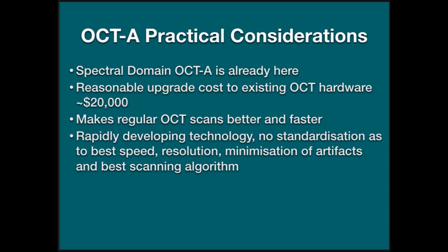We don't know what the best speed is to scan the retina. You know, the quicker we scan, the easier it is for the patient, but we'll miss blood flow because we're sampling too quickly. You know, what resolution do we need? Is it okay to scan each location twice or four times? The new NIDEK software that's just about to be installed will now do eight times, but is eight times going to be really better than four times, or is it just going to make the scan run longer? You know, what are we going to do to minimize these motion artifacts and reflection artifacts?